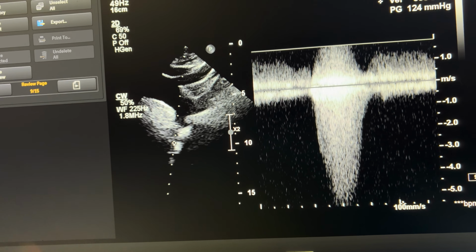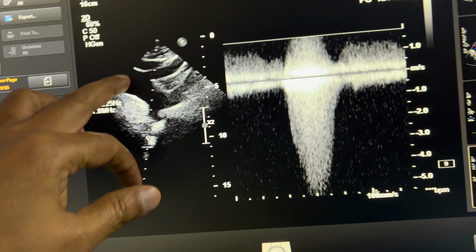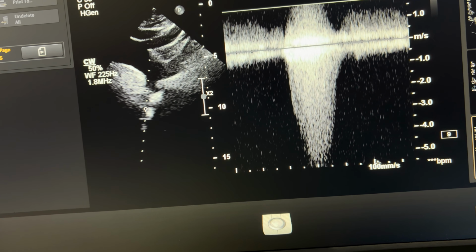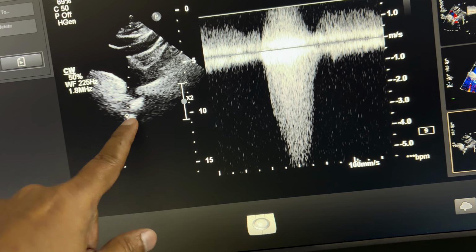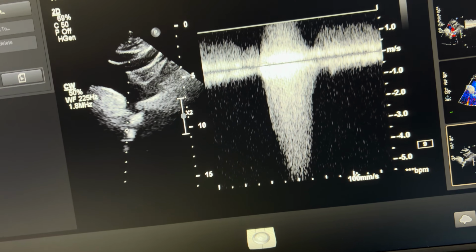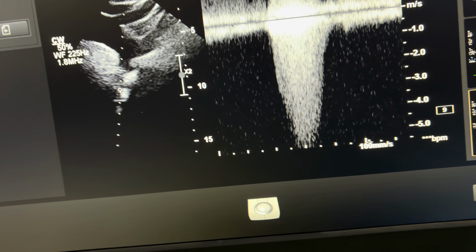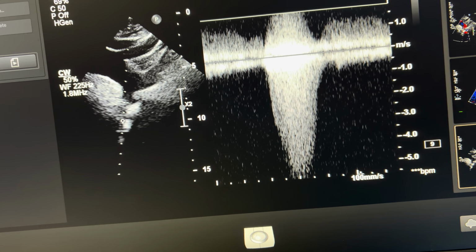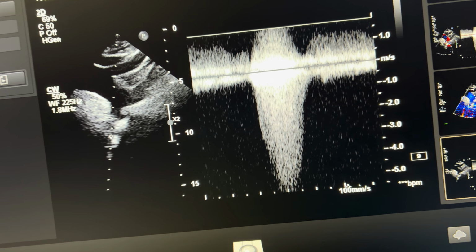So I had seen the bicuspid aortic valve with severe aortic regurgitation. I looked at the aortic arch in the suprasternal view. I missed it initially because this continuous line was not properly aligned, and because it is a very narrow part, the line must be aligned to this narrow part. Later on I found it, because I performed renal artery Doppler as the BP was not easily controlled. Then I got this point, very low velocity in both renal arteries. And then I suspected coarctation of aorta, and I finally got it.